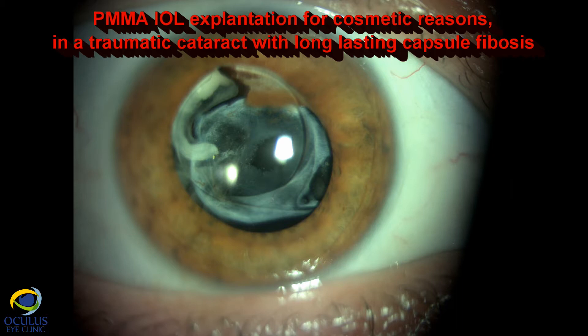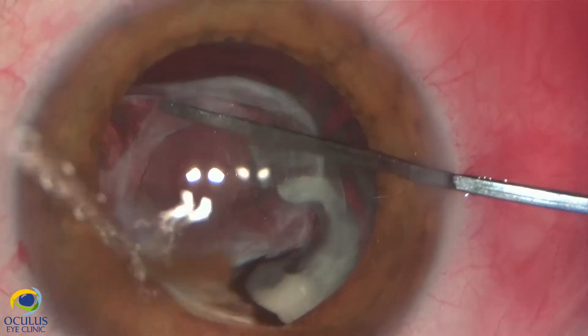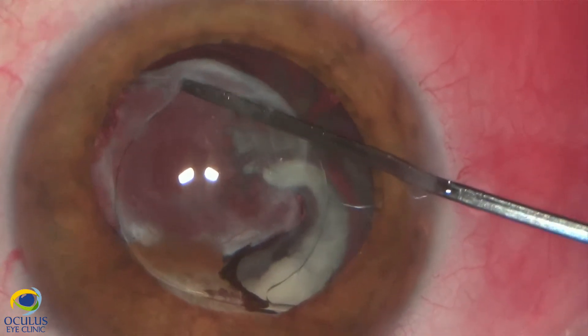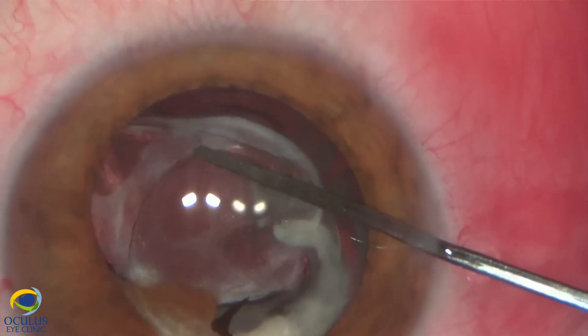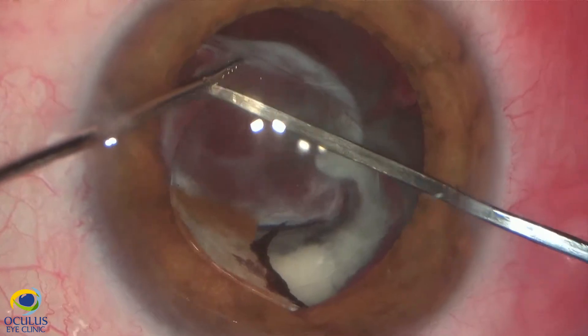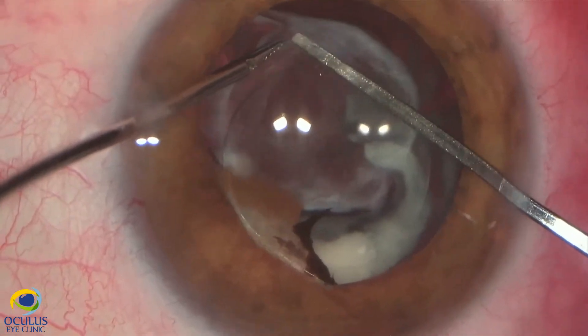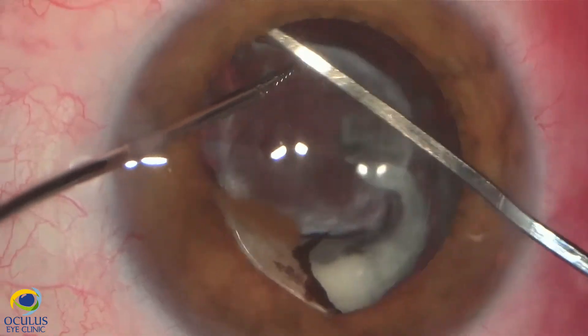We decided to see if it is a case to explant or not the IOL. The patient also had a YAG capsulotomy with a lot of YAG punctures of the IOL. We needed to remove the fibrotic tissue which was white and made the patient unhappy, and at the same time we needed to make the pupil more round to improve the cosmetic result.